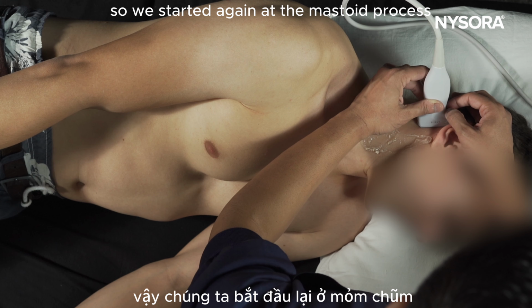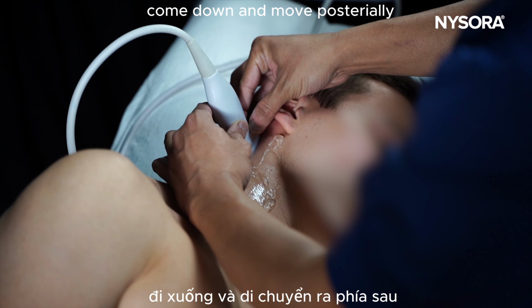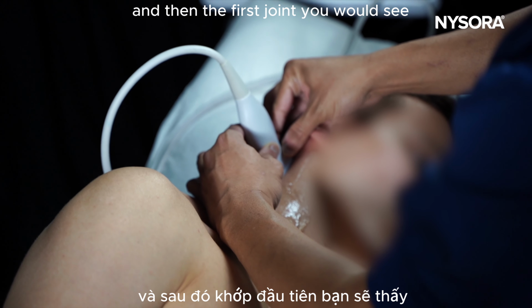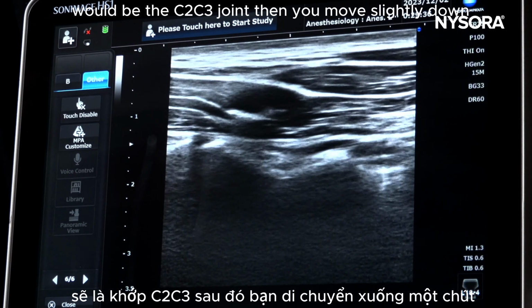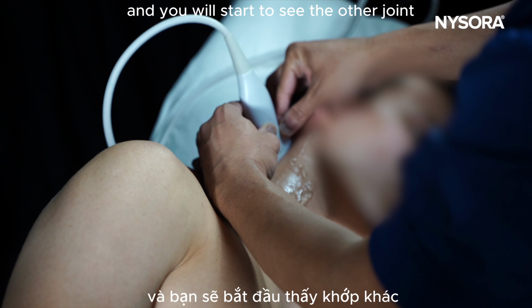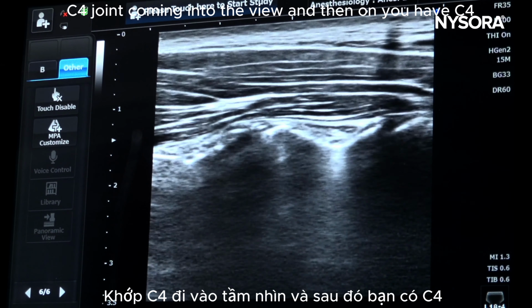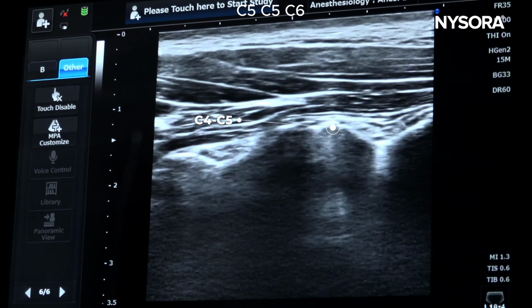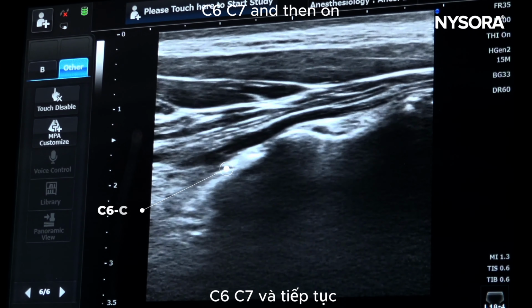So we start again at the mastoid process, come down and move posteriorly, and then the first joint you would see would be the C2-C3 joint. Then you move slightly down and you will start to see the other joint, that's your C3-C4 joint coming into view, and then on you have C4-C5, C5-C6, C6-C7, and so on.